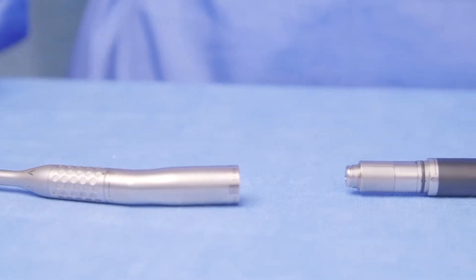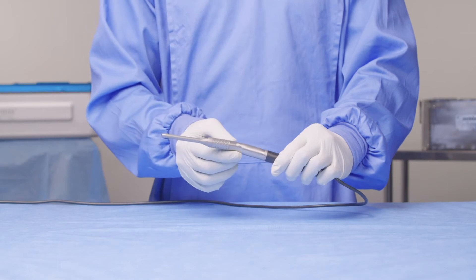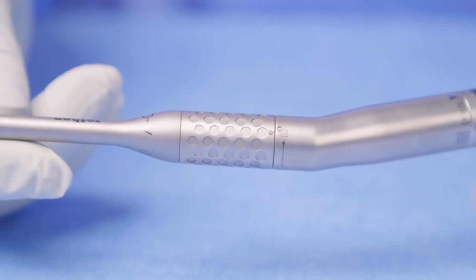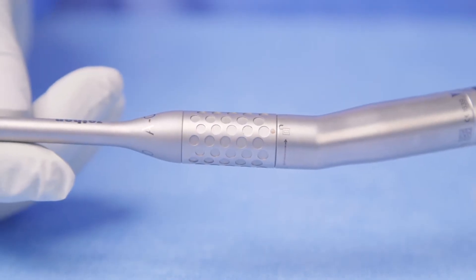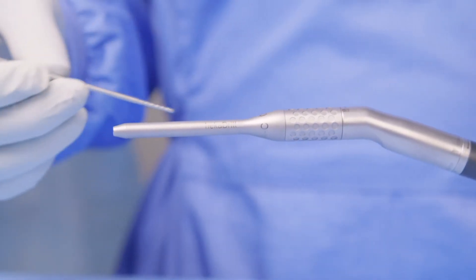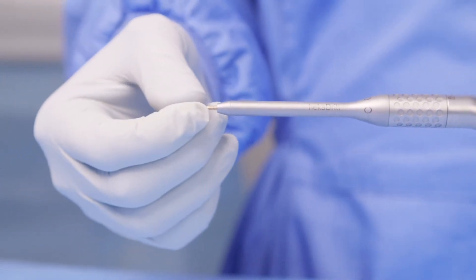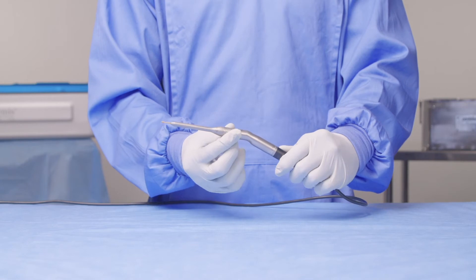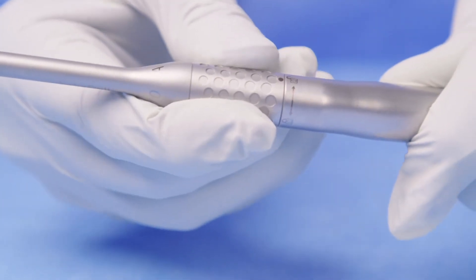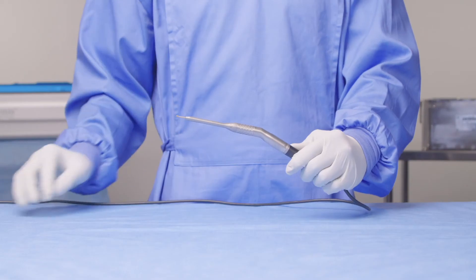Now let's take a look at how to attach an angled burr attachment to your Heka Drill handpiece. If you move your hands up the attachment, you'll find a second locking system. Ensure that it's in the unlocked position. At this stage, you can take your cutting accessory — such as a burr — slide it in through the nose of the attachment and firmly into position. Once in position, you can twist this locking mechanism to keep it in place. Once locked, you won't be able to remove the burr, and the system is ready for use.